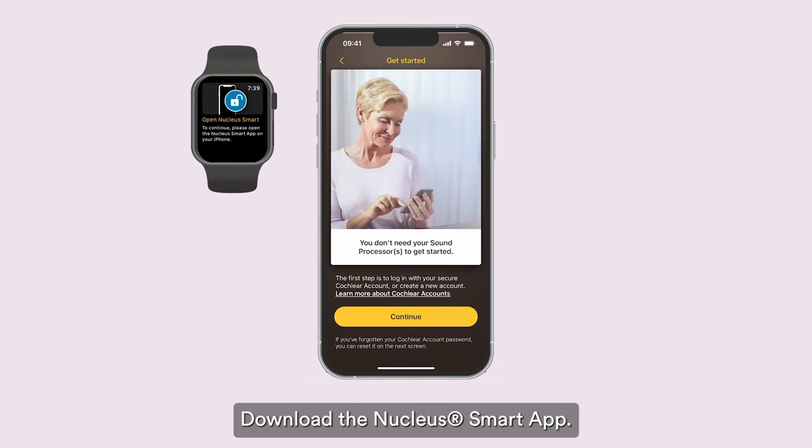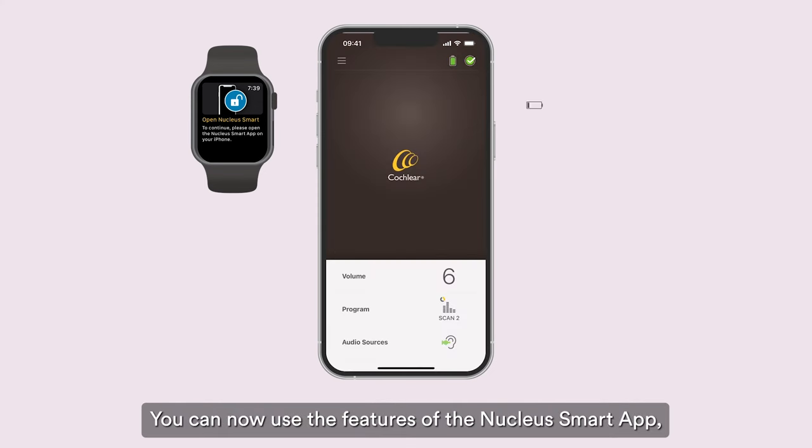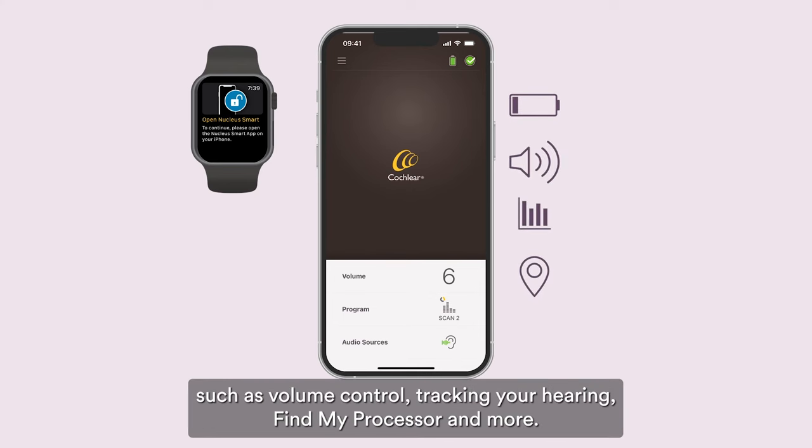Download the Nucleus Smart app. There are many great features to help and support you. You can now use features such as volume control, tracking your hearing, find my processor, and more.